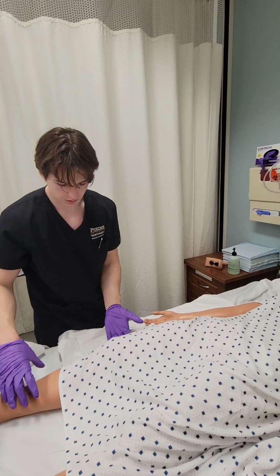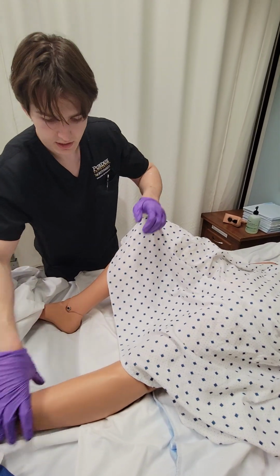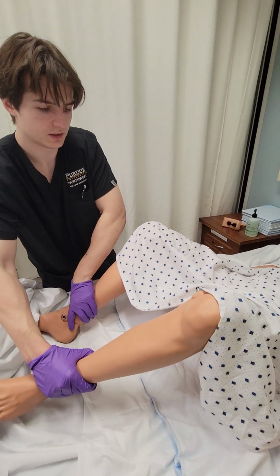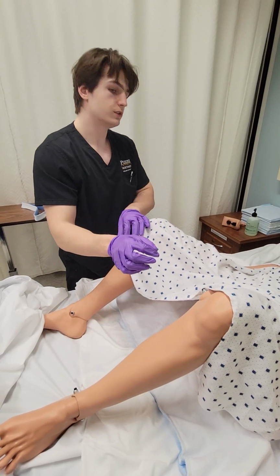Alright, so now I'm going to get your legs into position. Like that. And then the other here. Trying to put some space between the ankles. Alright, I'm now going to roll up your gown.